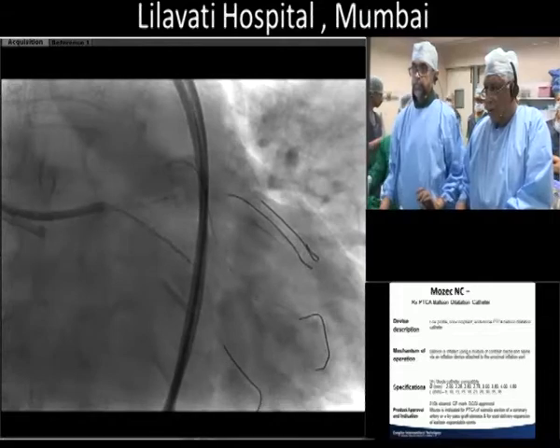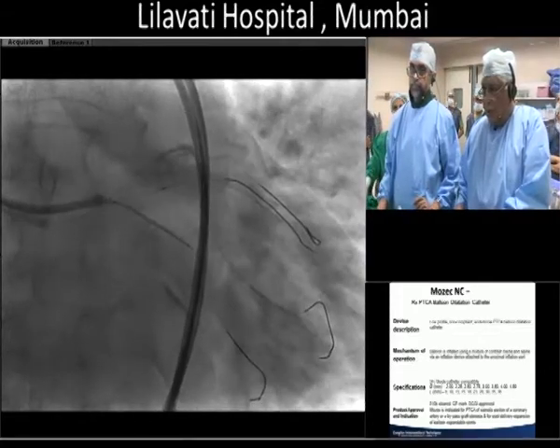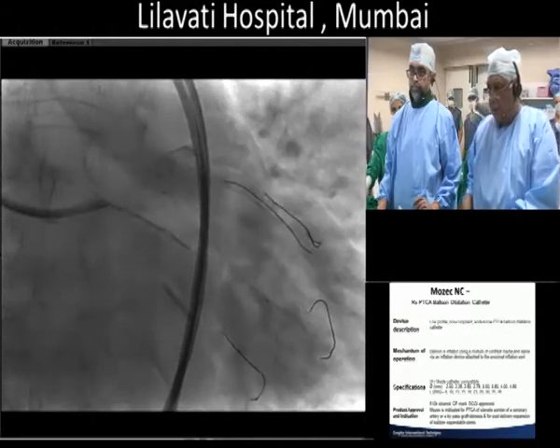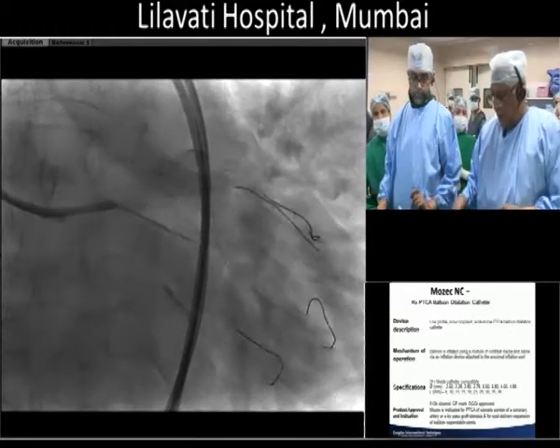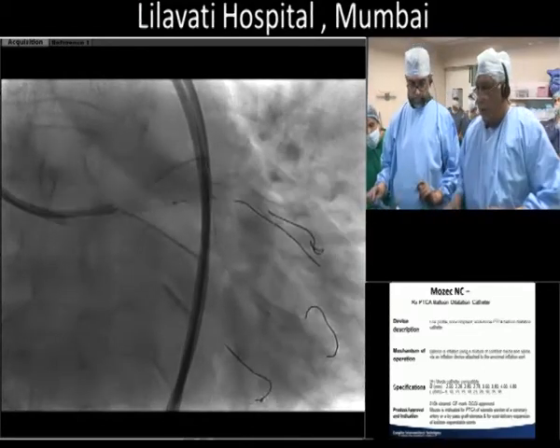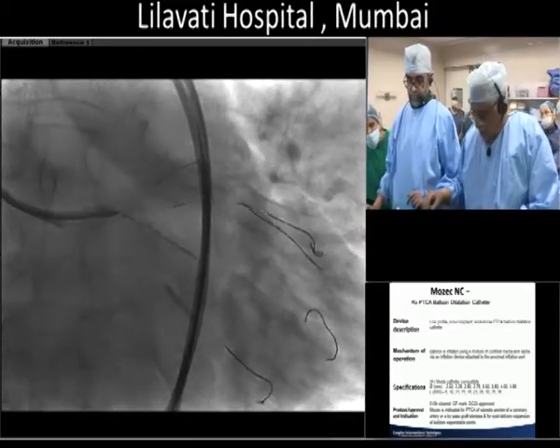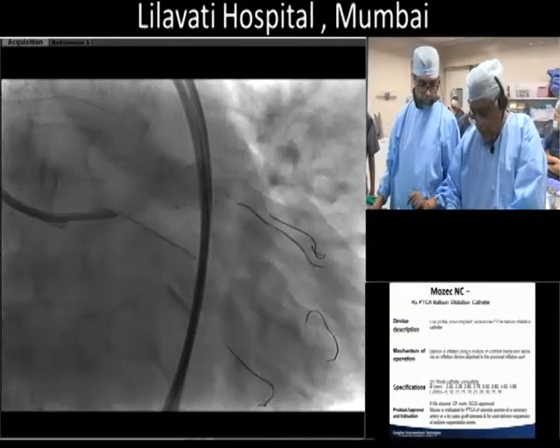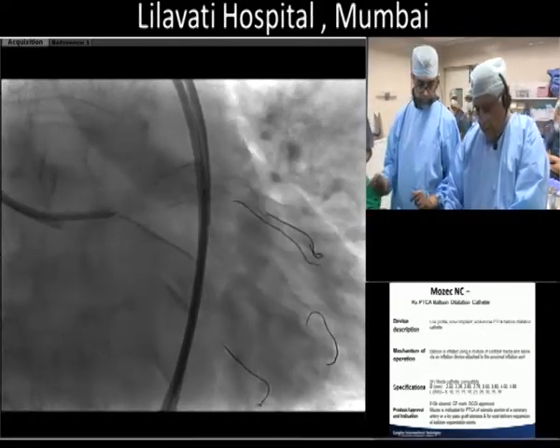So now he's going to put a balloon parked in the LAD from the other guide. Yeah, that's right. It is parked. Then they're going to go to an LAO caudal and deploy the stent. Go to LAO caudal, please.